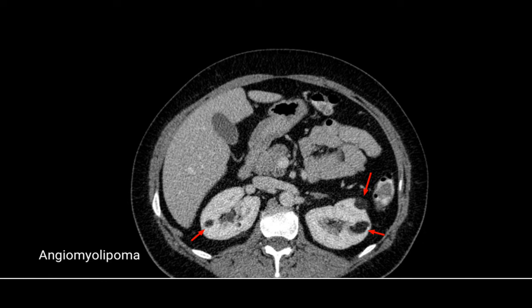Angiomyolipoma is basically a tumor having angio meaning blood vessels, myo meaning muscles, and lipoma meaning lipid-laden fat cells. To identify it in a CT image, we can see the two kidneys and in the kidneys there is a blackish shadow. This black color is due to fat, so it is representative of angiomyolipoma.